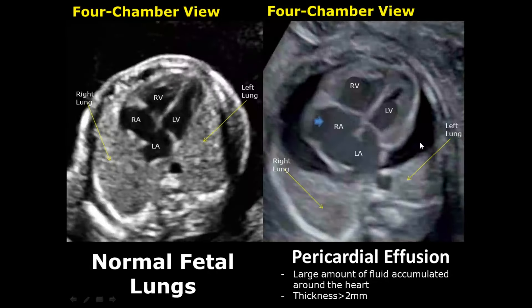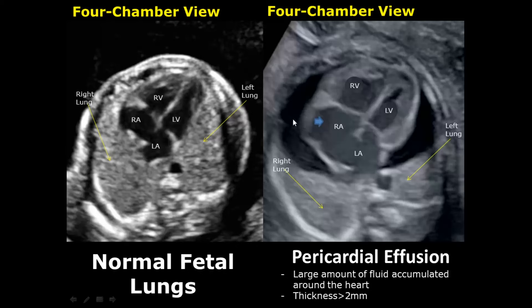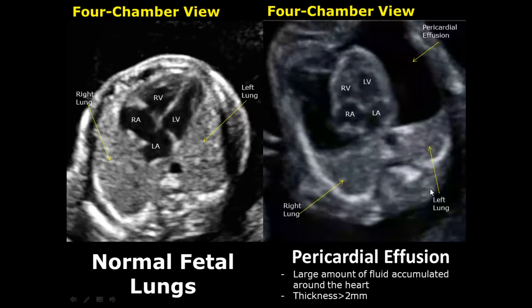Pericardial effusion is the accumulation of fluid around the heart. We can see this anechoic fluid around the heart. If the thickness is 2 mm or less, it is a normal amount of pericardial fluid, but if it is more than 2 mm it will be pericardial effusion. In this image, we have a large amount of fluid collection around the heart — a severe case of pericardial effusion.